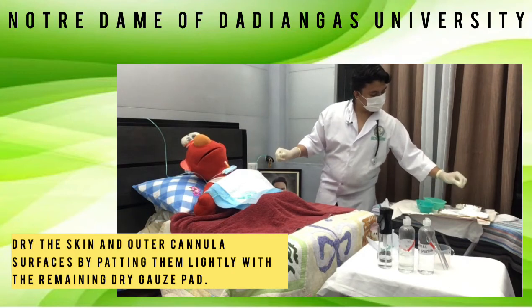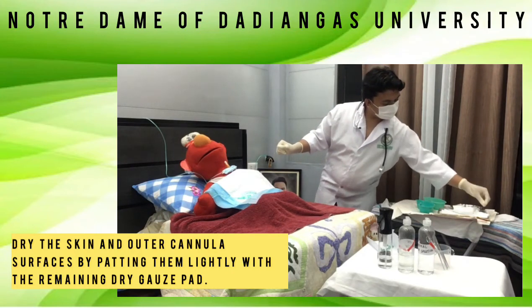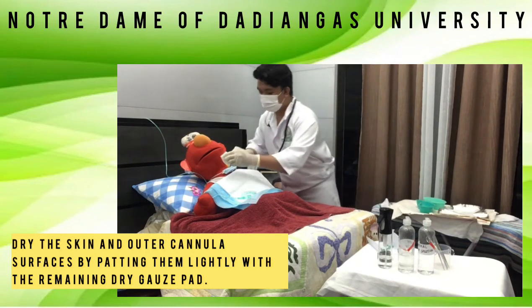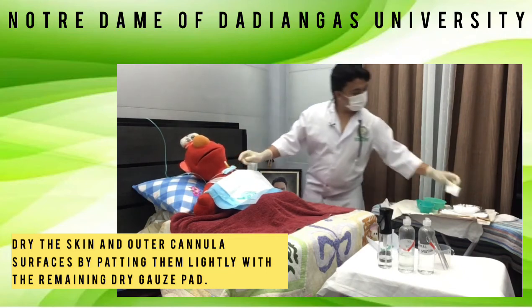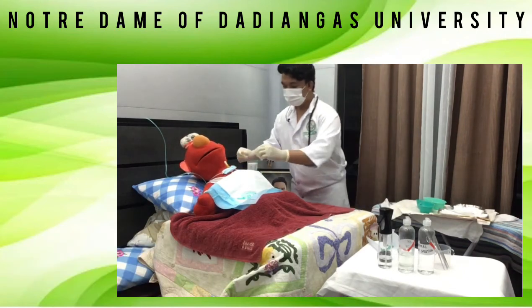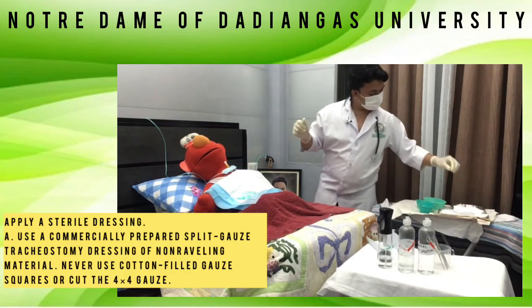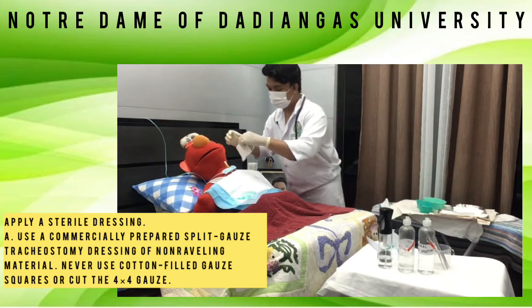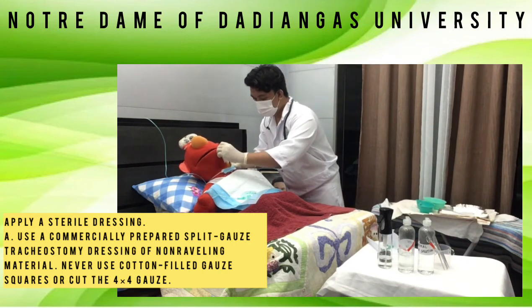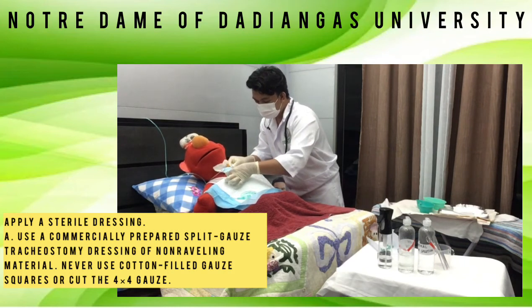Dry the skin and outer cannula surfaces by patting them lightly with the remaining dry gauze pad. Apply a sterile dressing. Use a commercially prepared split gauze tracheostomy dressing of non-raveling material. Never use cotton-filled gauze squares or cut the 4x4 gauze.